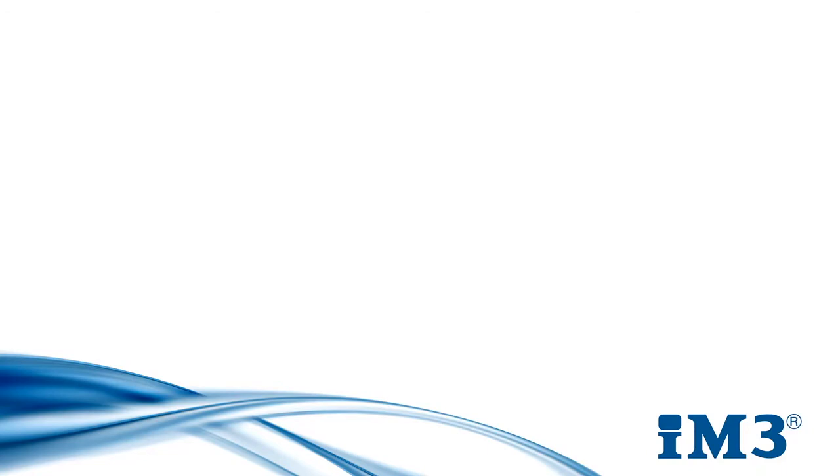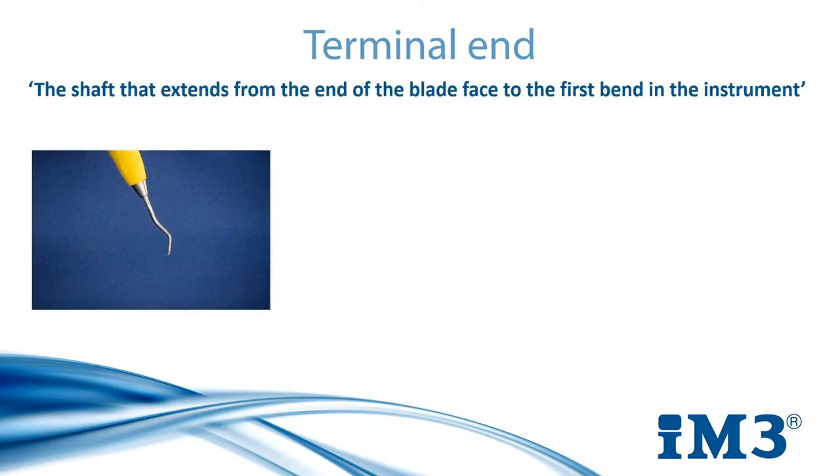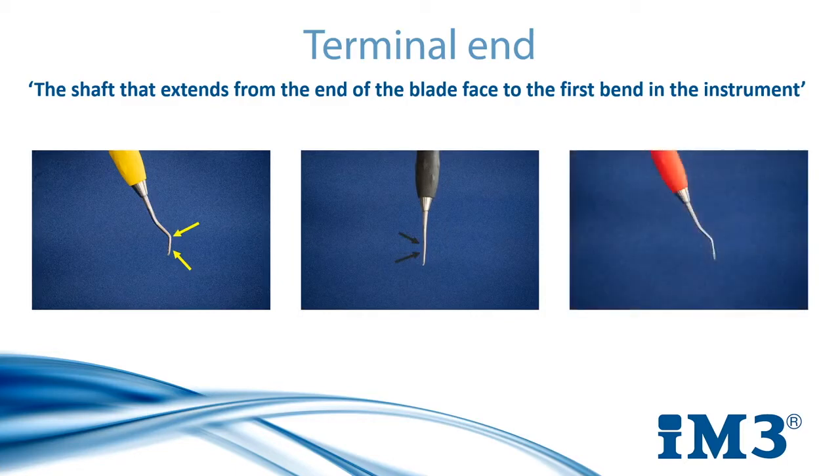We are going to start by looking at how to sharpen our scaler and our curettes, but before we begin there's a very important landmark called the terminal end that you need to locate on each instrument. The terminal end is the shaft that extends from the end of the blade face to the first bend in the instrument. It varies for each one but the same principle applies. As you can see on screen, we have our universal curettes on the left, our Gracie curettes in the middle, and our universal scaler on the right. The terminal end is the shaft located between each of the arrow points.